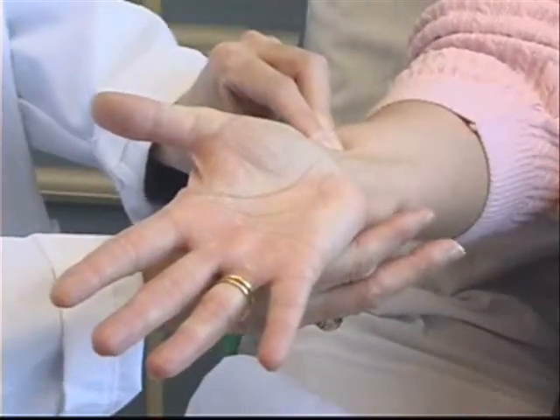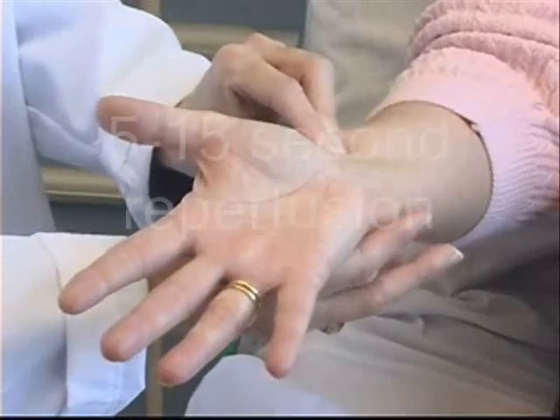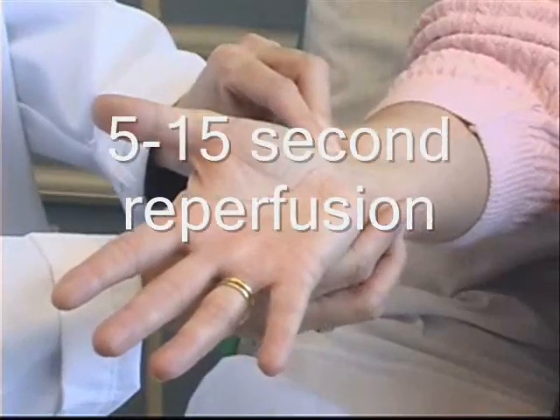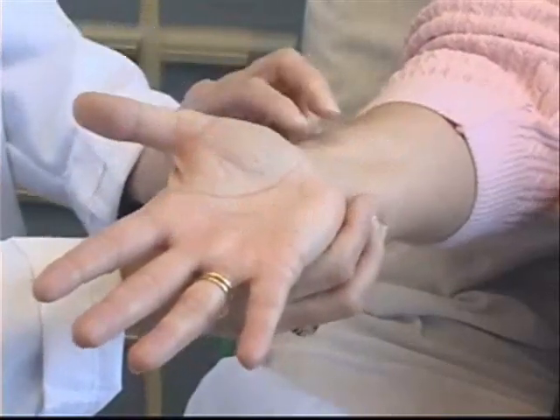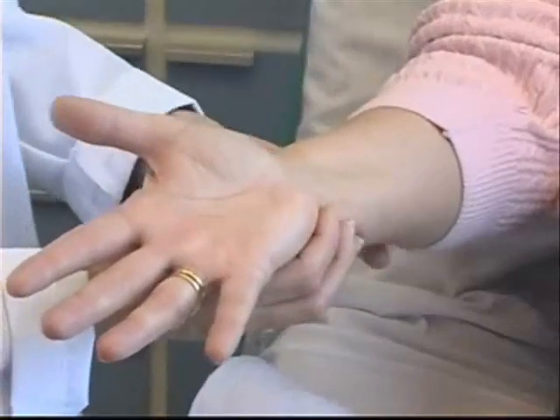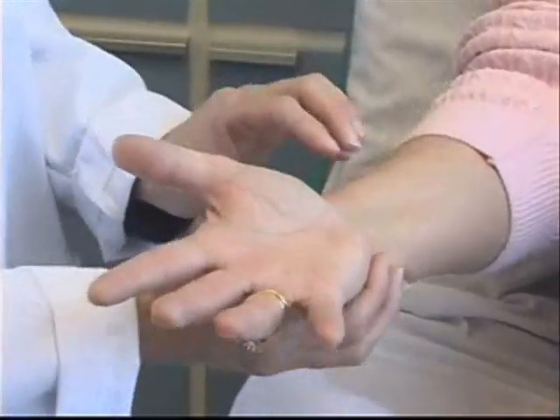What I'm watching for is good flow returning to that hand. The hand pinks up nicely. I now have a positive Allen's test and I am okay to proceed with the procedure.